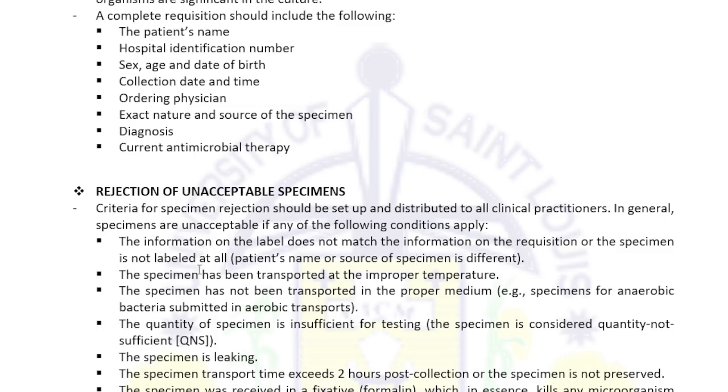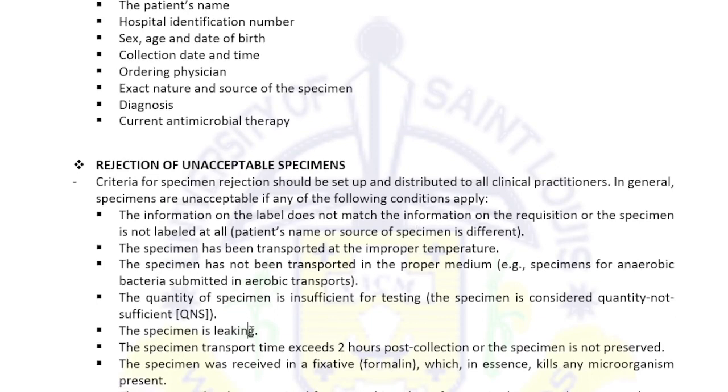Reject na yun. The specimen has been transported at the improper temperature. Okay, reject. The specimen has not been transported in the proper medium. Reject. Okay, the quantity is not enough. Kulang. QNS, quantity not sufficient. Kulang yung volume. Nagli-leak. Reject. Pag more than 2 hours from the time of collection and hindi siya na-preserve, pwede mong i-reject.